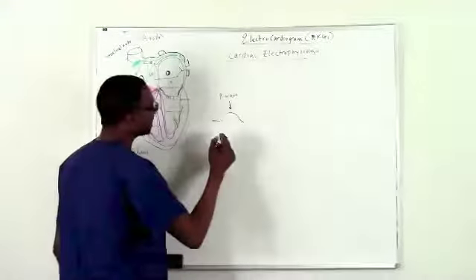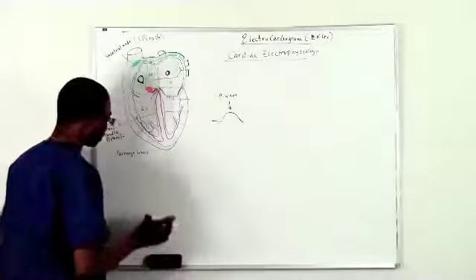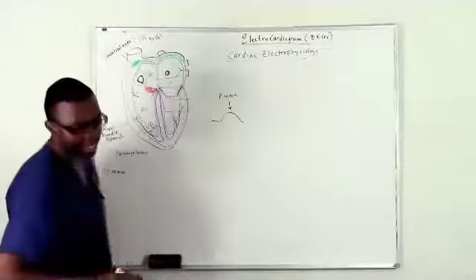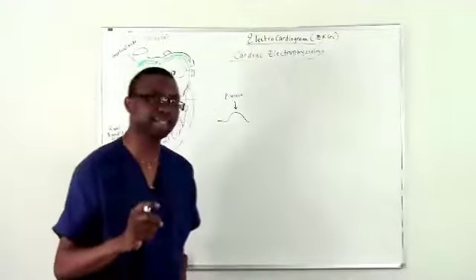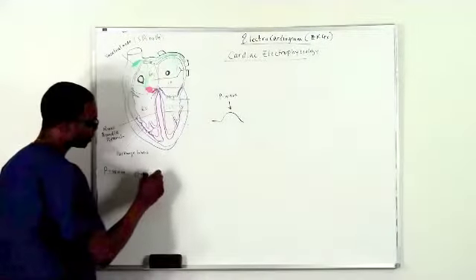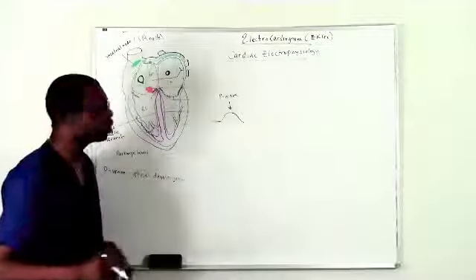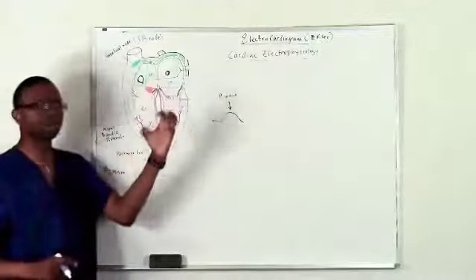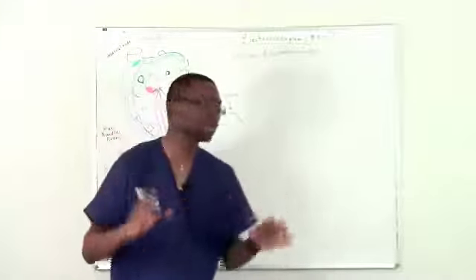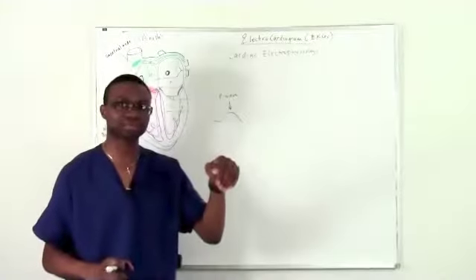Well, what is the P wave? Let's write on the board here. The P wave actually represents atrial depolarization. Atrial depolarization, which means when the atrium depolarizes, what we see on a 2-dimensional piece of paper is this upstroke potential. You just look at the little bump. It's positive.